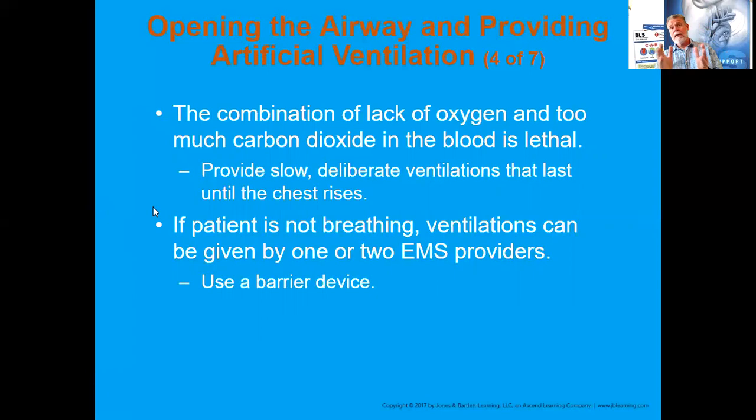I did replace this. This had terminology on there that said breathe for 1 second. There's a whole bunch of different size and shape patients that you could have out there. And I got a patient now who is, you know, 6'5", 350 pounds. If I'm only ventilating for a second, maybe I don't even see the chest rise, right? What is their tidal volume? But when we go back and just think of how would you deliver a sufficient amount of oxygen to your patient, or what would be your key indicator of that, then we would say breathe in until the chest rises, right? It decreases the chance for gastric distension or gastric inflation. Patients not breathing, ventilations can be given by one or two EMS professionals. They can. And this just depends.